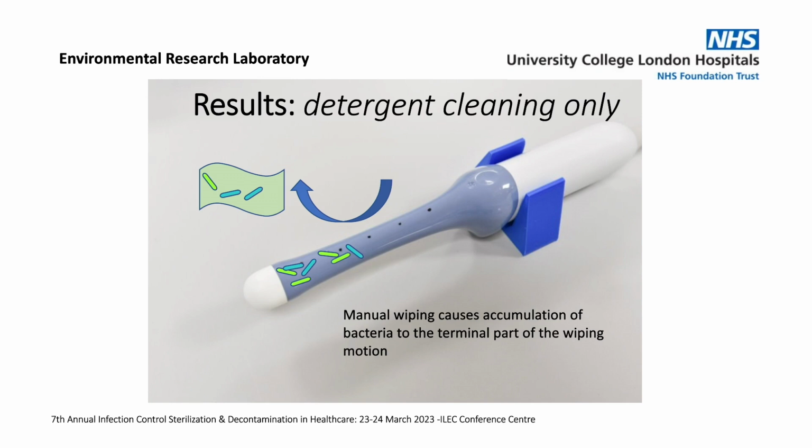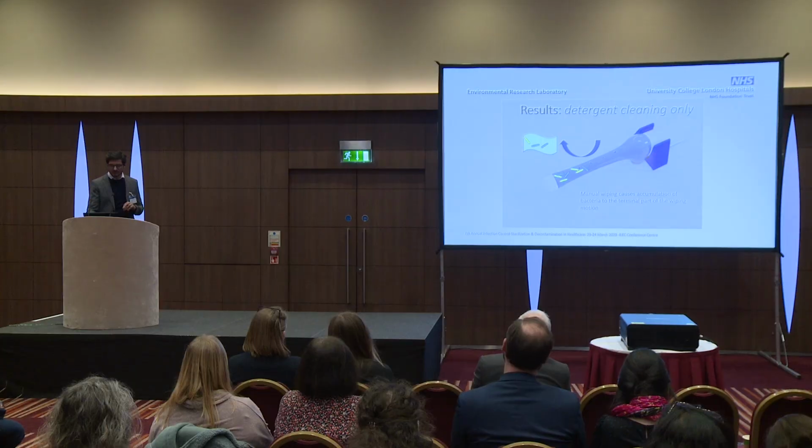And in general cleaning, it occurs in one direction, you never go back on yourself. So we know that there will be spots where whichever type of reprocessing you'll be using, you would have to make sure there's focus or attention to these high risk areas or hotspots.